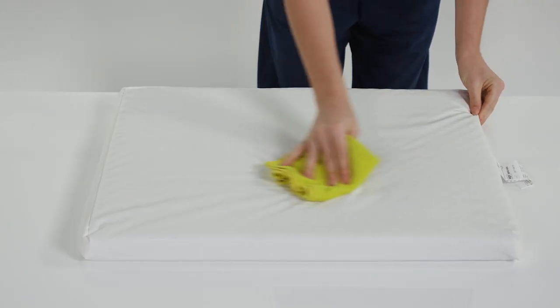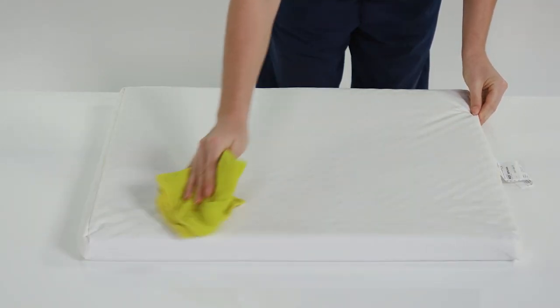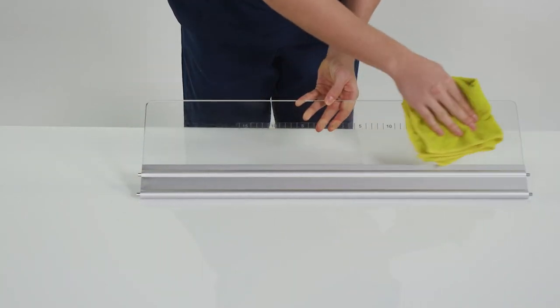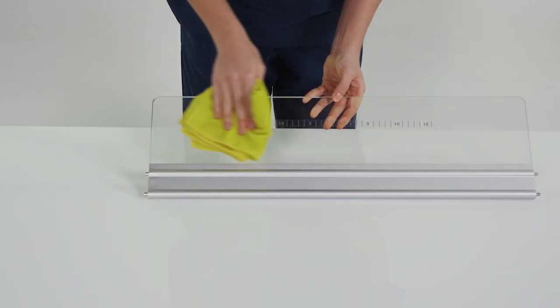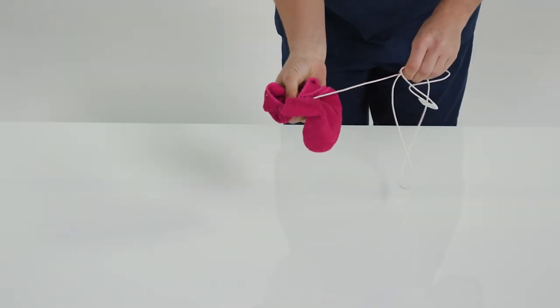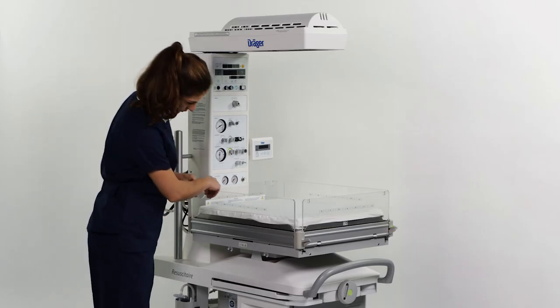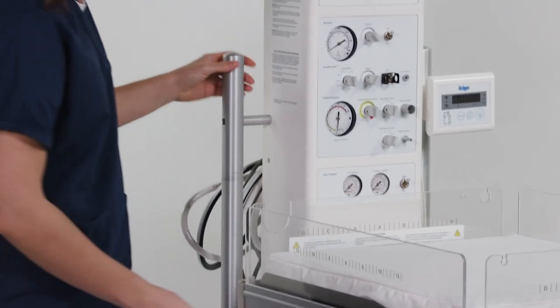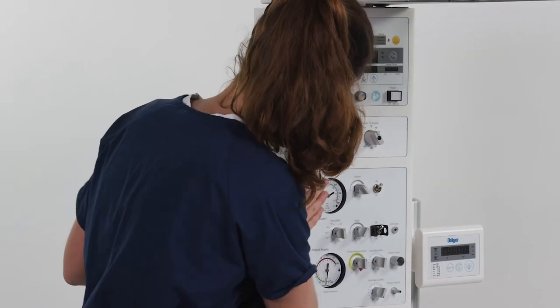Special care should be taken when cleaning and disinfecting the following components: clear plastic and acrylic surfaces, metal surfaces, and reusable skin probes. Perform a visual inspection to check items for damage and external signs of wear, such as cracking, embrittlement, or pronounced hardening and residual dirt.